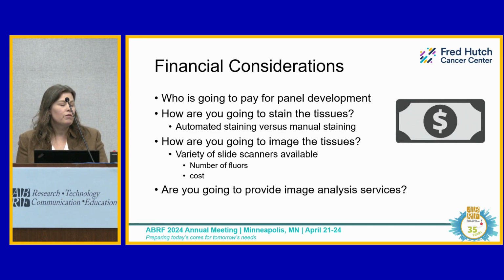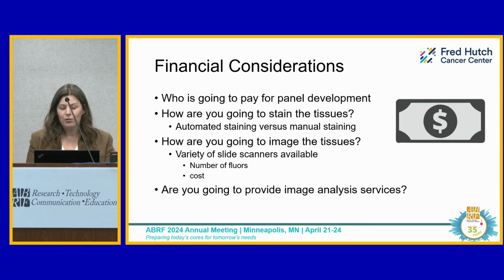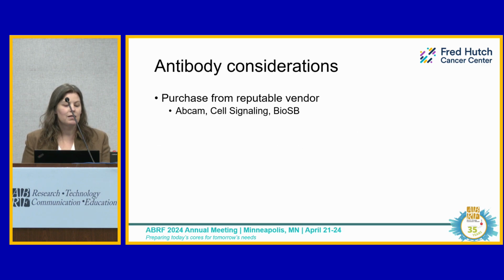And then are you going to provide any sort of image analysis service? There are different softwares that you can purchase. You may choose to provide a service where you can help train them how to use this, or you may simply say, no, that's not in our purview, you're on your own for something like that, which some services will do. So you need to figure that out ahead of time and build that into your practice.